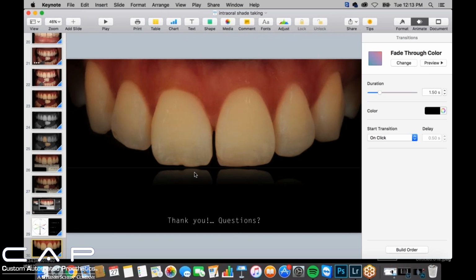Using a diffuser might make it look a little bit better, but then you're also altering the surface texture and the luster and a lot of detail that you want to see. So I would not recommend using an overhead stock flash. If I had the choice, I certainly wouldn't.